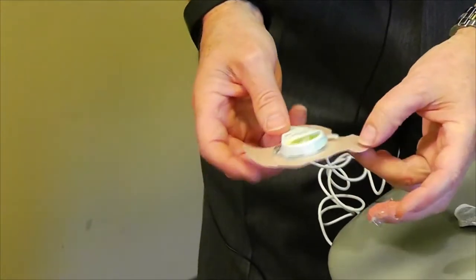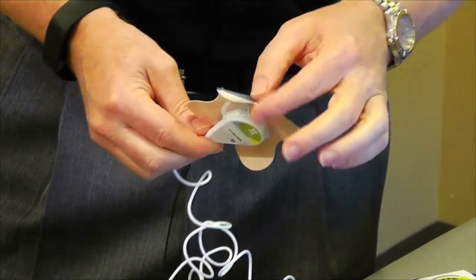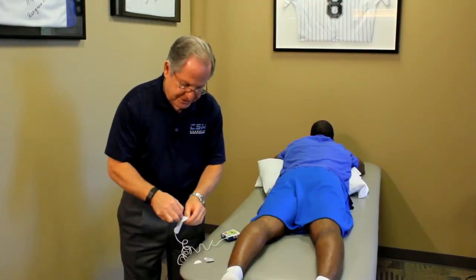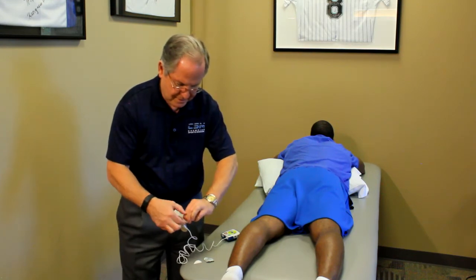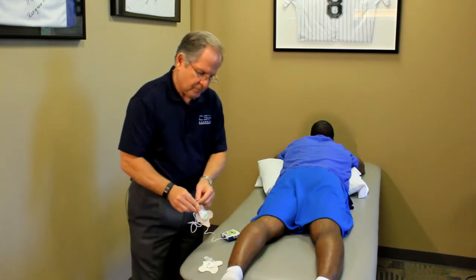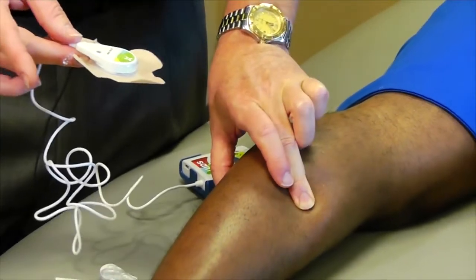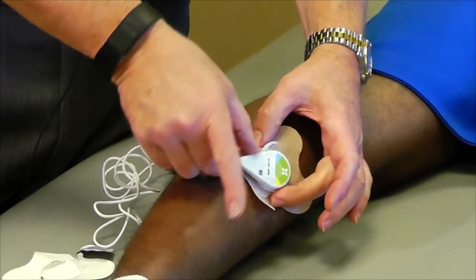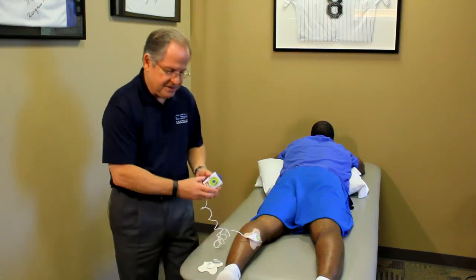Once snapped in, the device is on and looks almost like a TENS unit. We peel off the adhesive component — there's coupling gel all over it so it's going to work really well. Through palpation, and having treated this patient for a while, I isolate the specific spot on the calf, place the pad right on that spot, and then turn the device on.